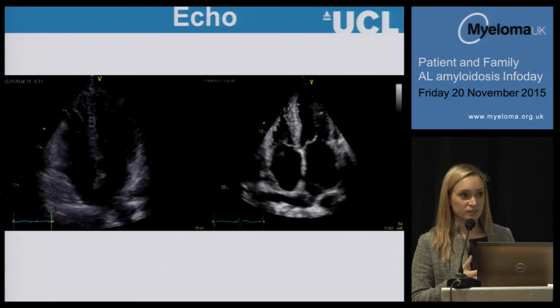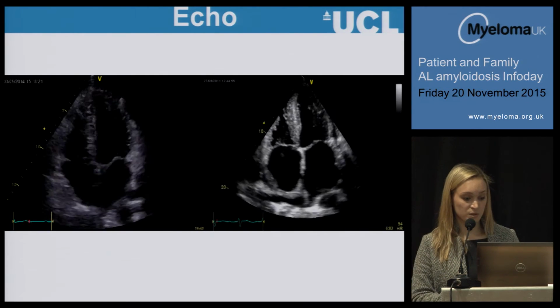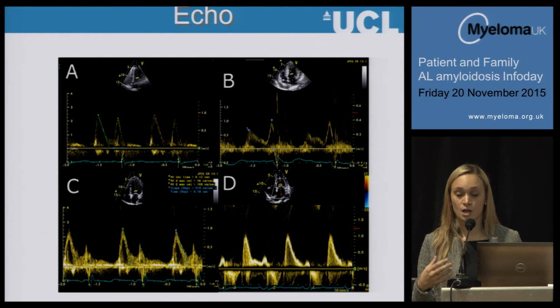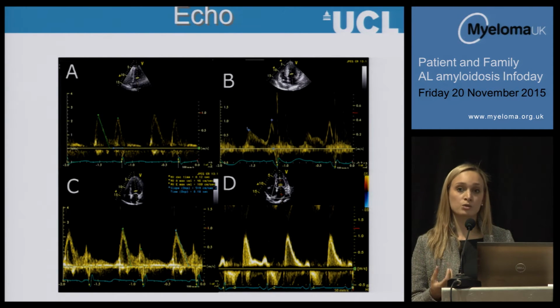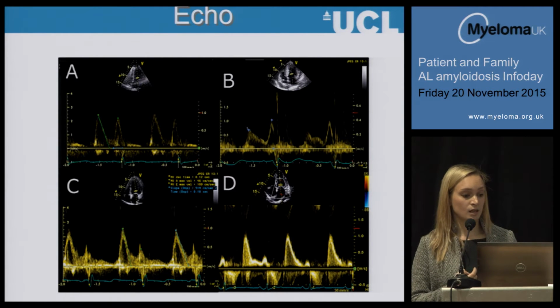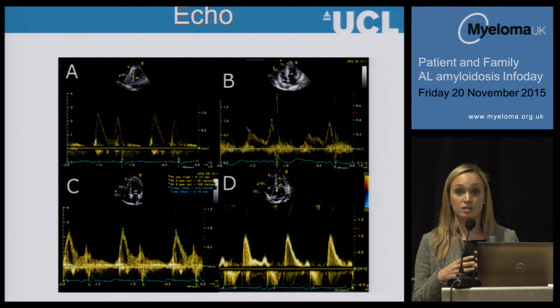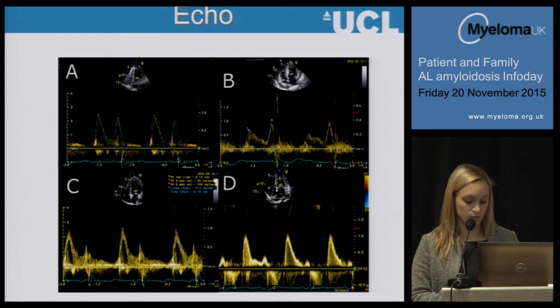But as you probably know, the echocardiogram sometimes takes a long time, and the reason for that is because we take several measurements to assess the function that is mostly impaired in cardiac amyloidosis, that is the relaxation. With all these little waves, we have an idea of how is the relaxation capacity, how stiff is your heart with amyloid deposition.